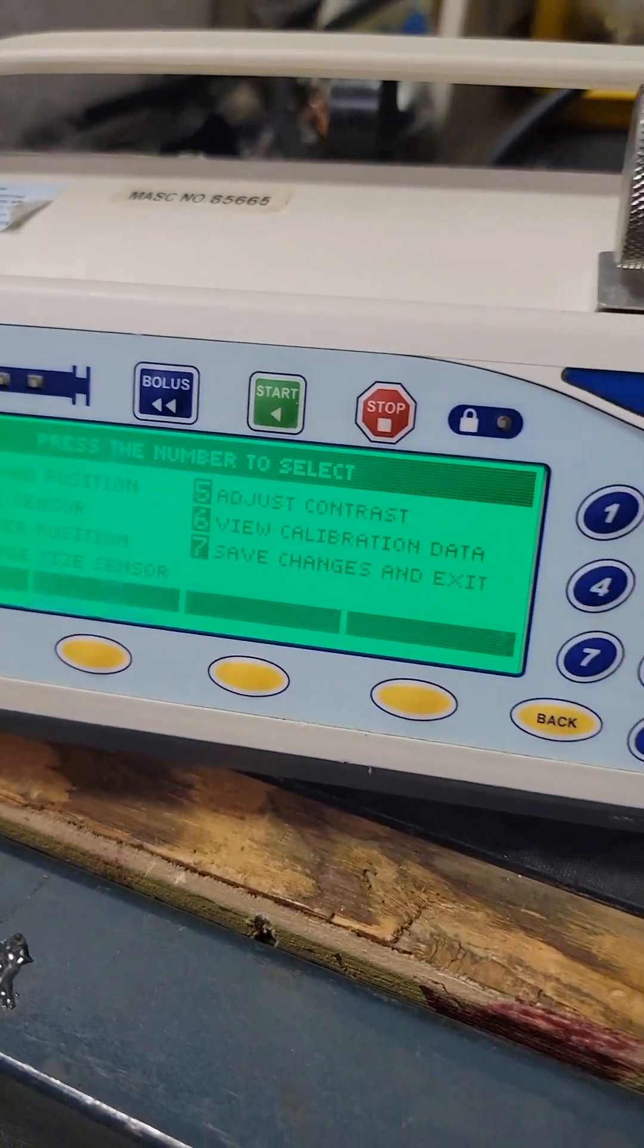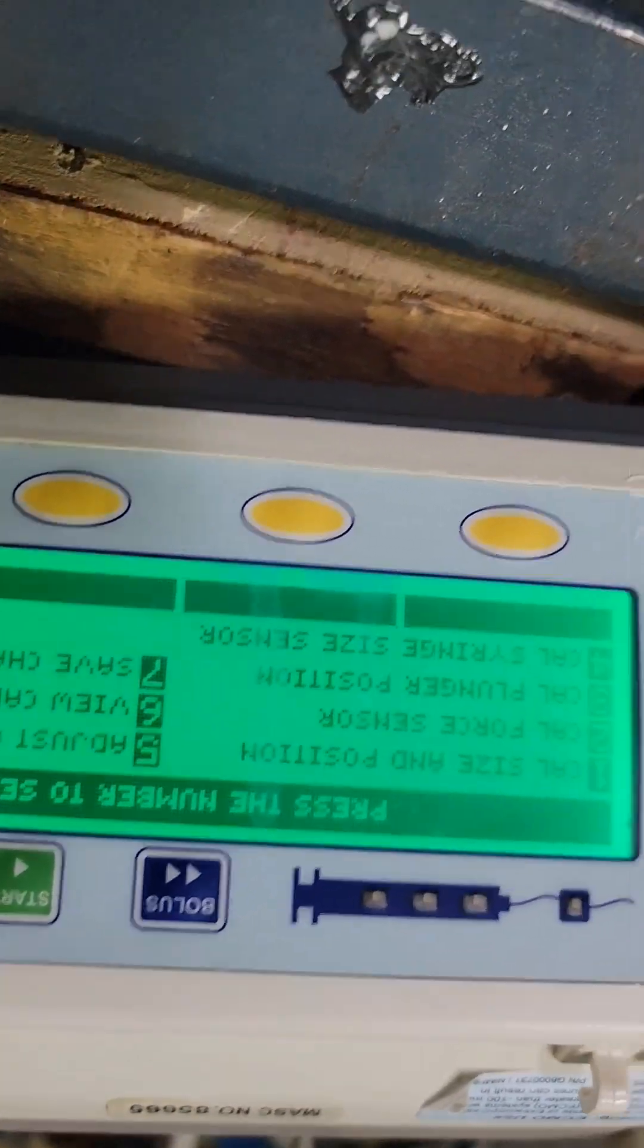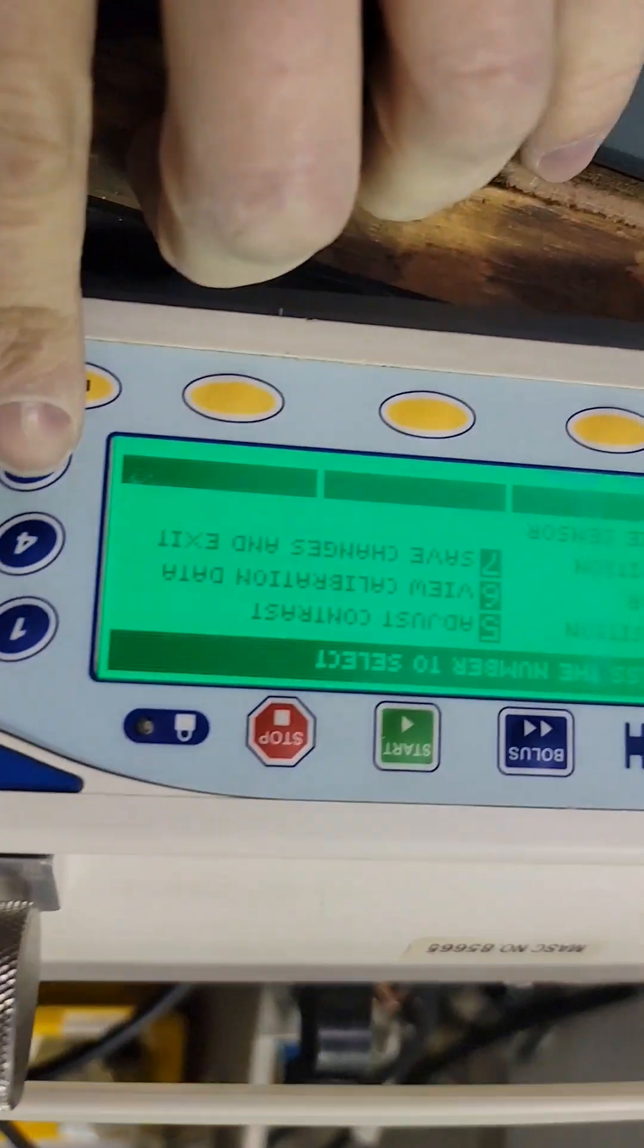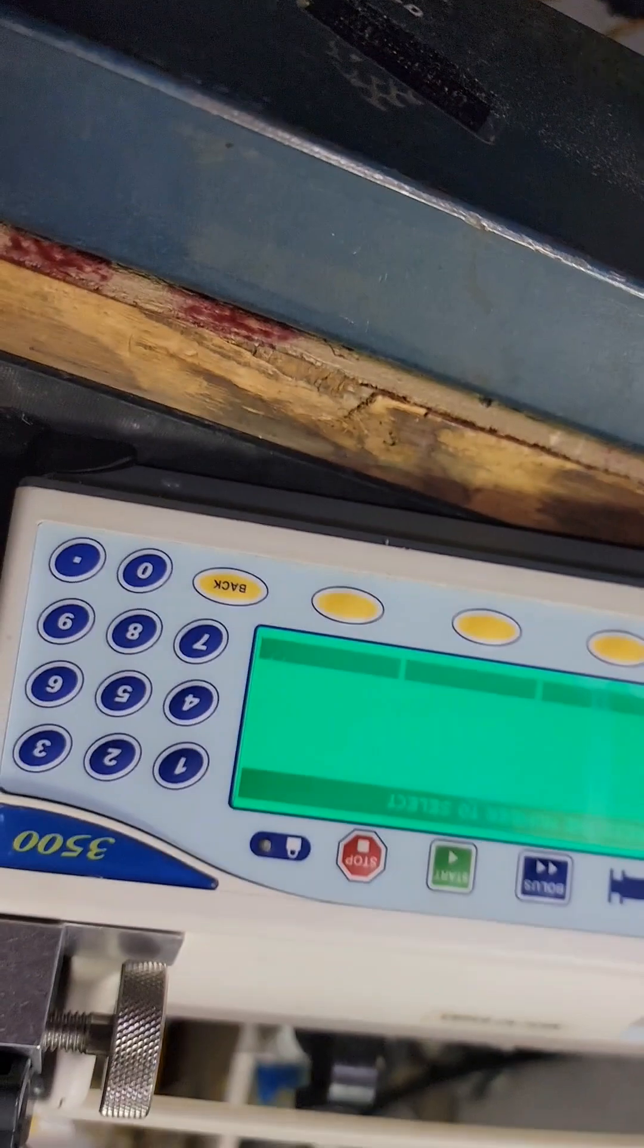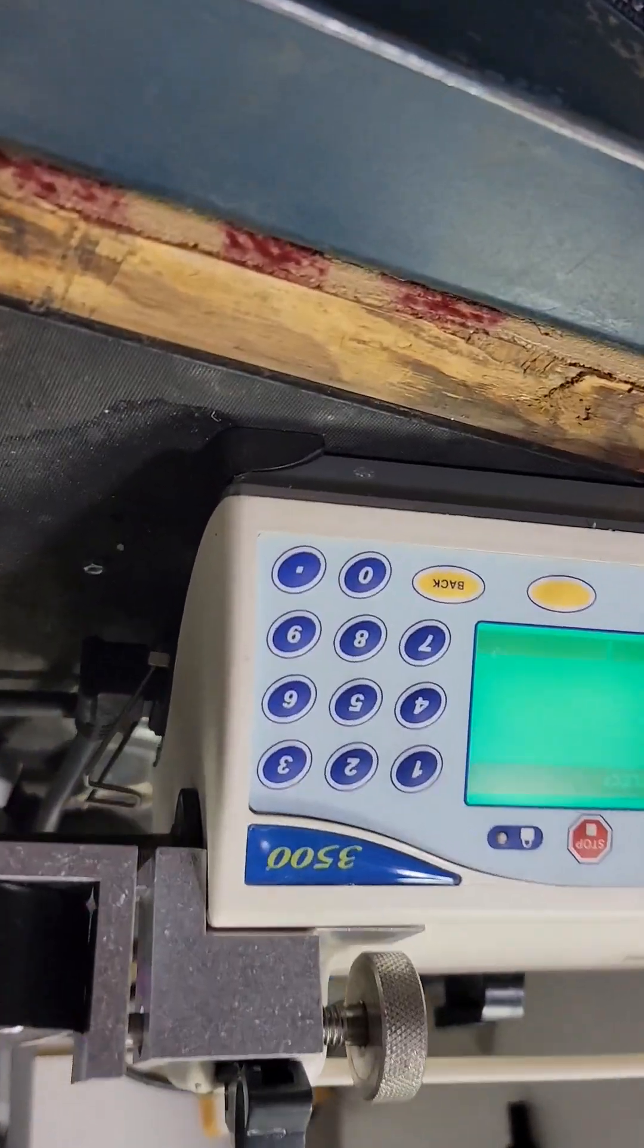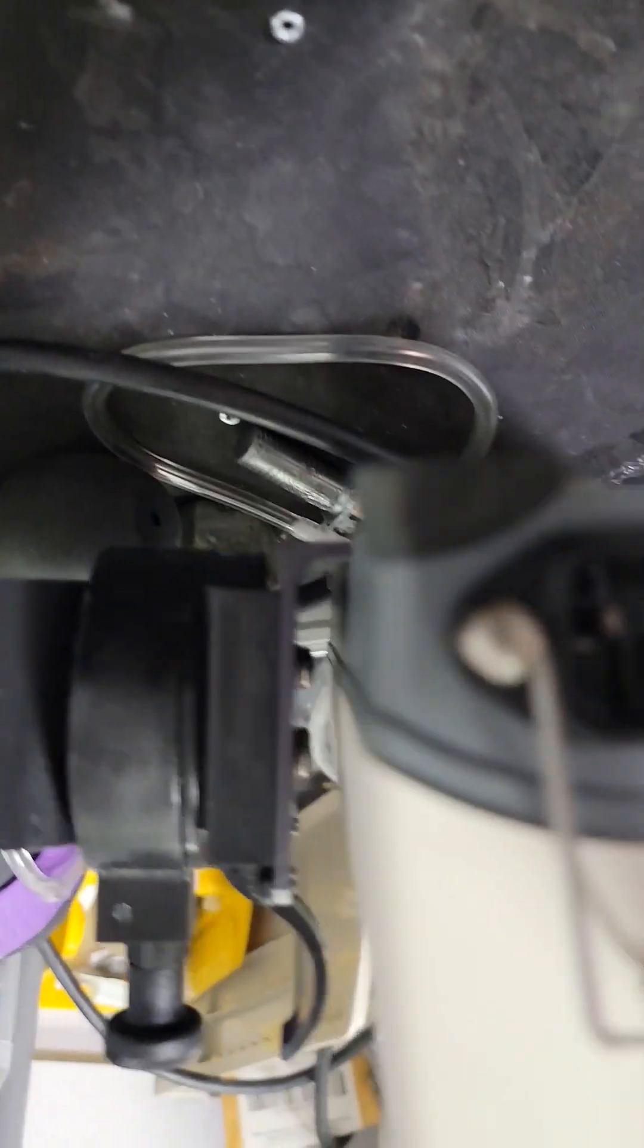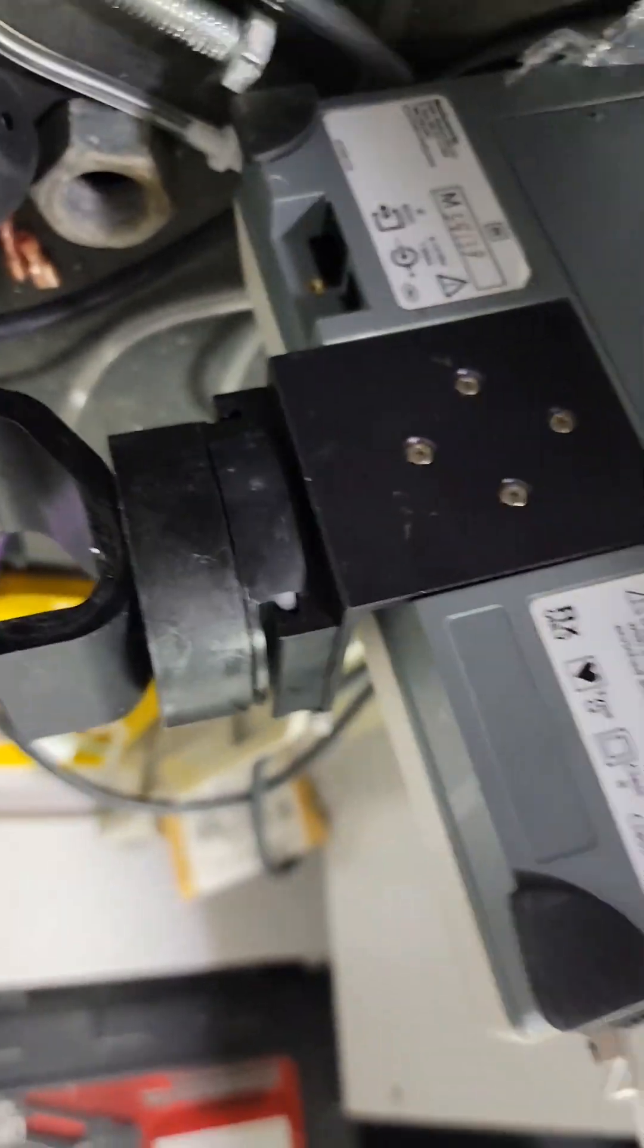That was the calibration. When you're done make sure you save changes and exit. There's no point in doing electrical safety because you don't have a ground pin in case you haven't noticed. This is a double isolated device, there's no electrical safety.